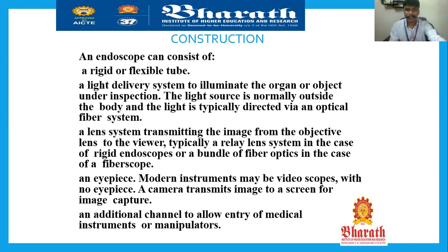A light delivery system: a light mounted above the camera is known as the light delivery system, used to illuminate the organ or object under inspection. The internal view will be clear when light penetrates the internal structure. The light source is normally outside the body and the light is typically directed via an optical fiber system.